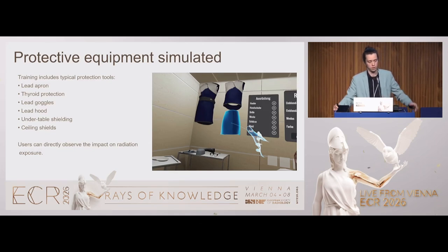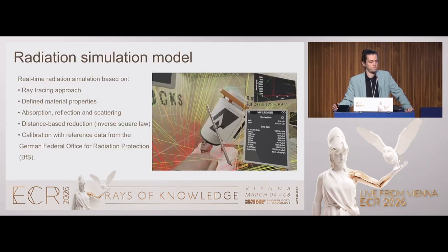Many different protective measures like the aprons and goggles and the hood and under table protection, shields and barriers and all of that. And it's also still evolving. So if you have any suggestions, anything to add to the application, we're always open. And yeah, you can really see the radiation.